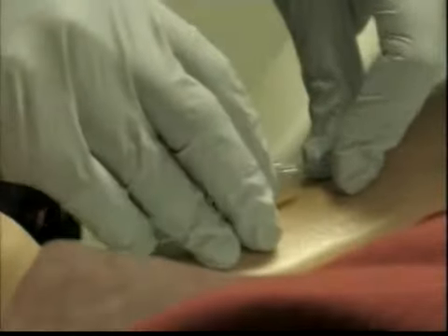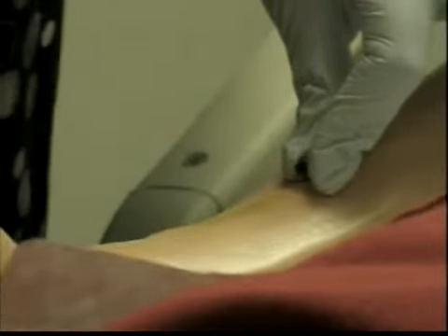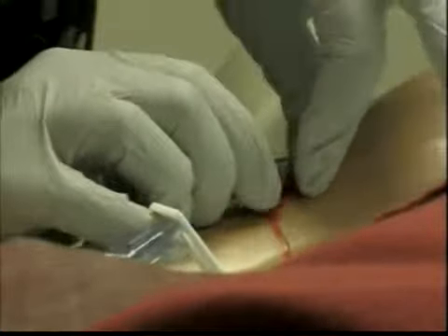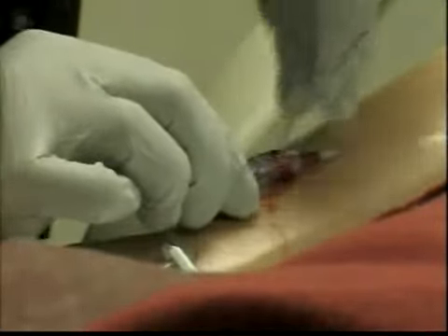It's going to be a little bit of blood, but you do it in a sweep motion. So you want to make sure that you remove this, cover it, and then you're going to connect it, and you're going to twist it. Look at my fingers where they're at. I'm holding the hub, and I am performing a twisting motion to lock this in place.